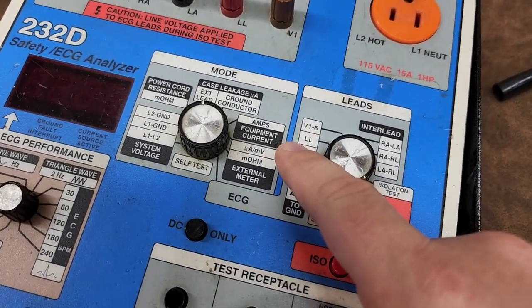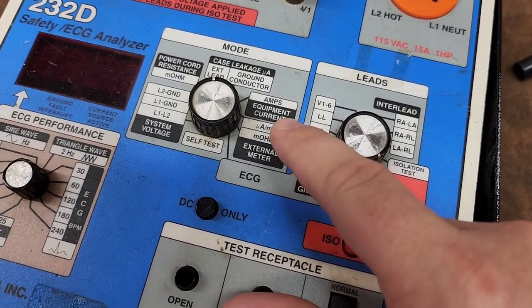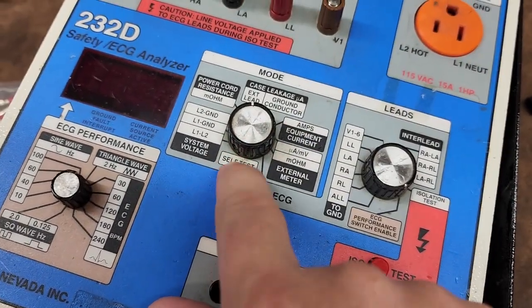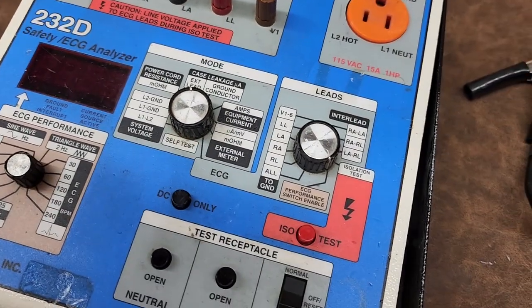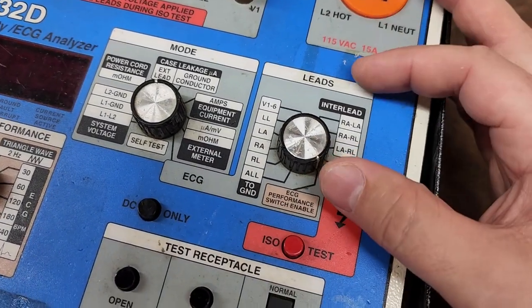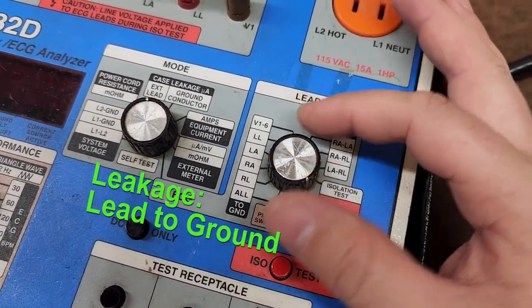Over here we've got microamps, millivolts, and milliohms for the external meter functions. There's also a self-test down here so you can test your analyzer yourself. These are all your ECG functions — interlead and the others — any of you biomeds know the drill.